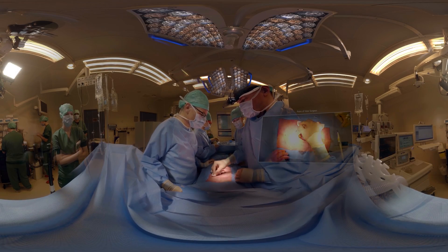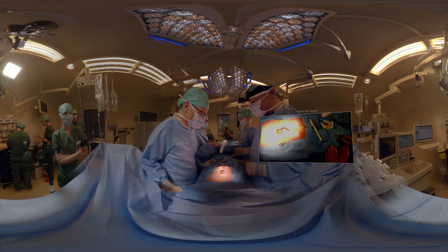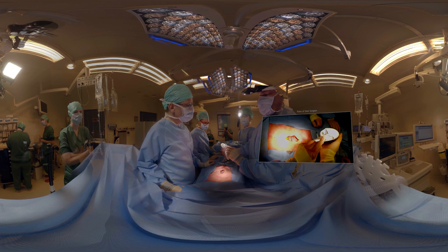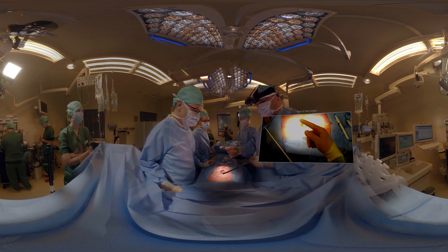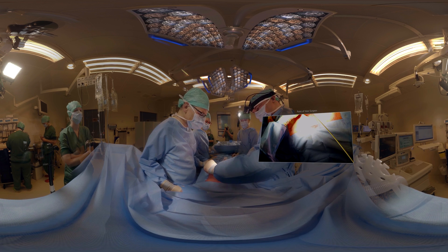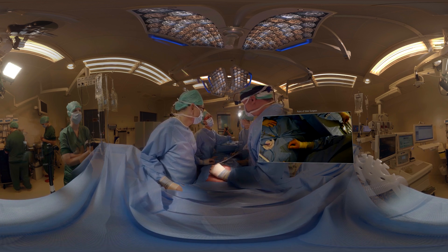The mesh is now well positioned — can we have the Sorber Fix? You can see the shape of the tacker here, which is rotated into the fascia. We're going to secure the mesh.